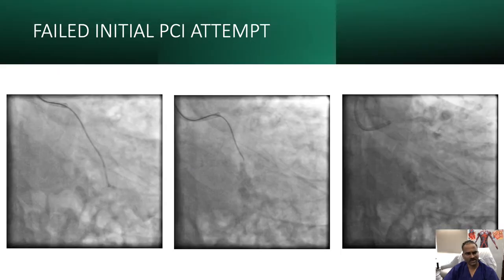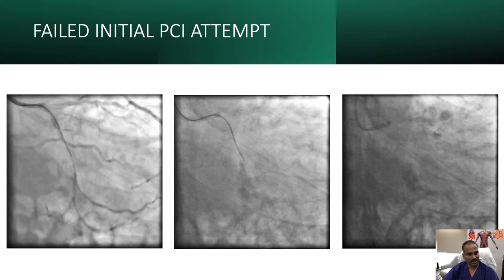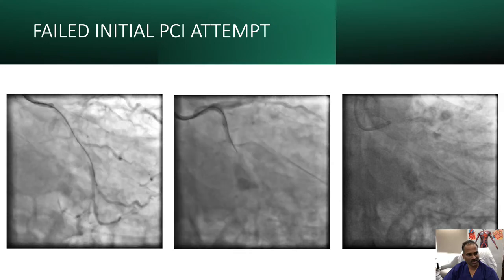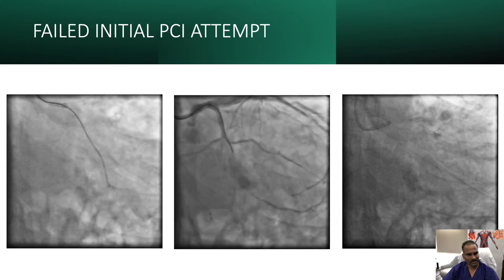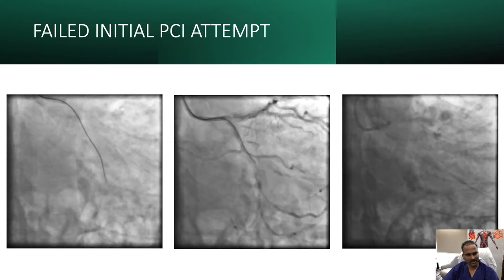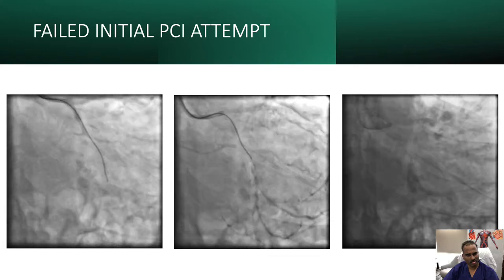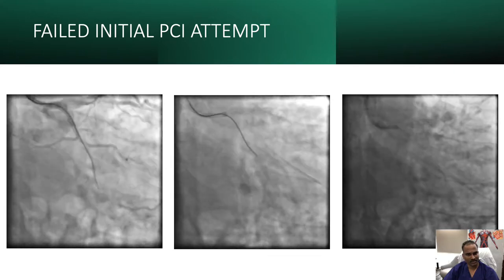The right coronary is basically non-dominant, small vessel, normal. During the first attempt, a Gaia wire went subintimally. After pulling back the wire, there is a clear subintimal contrast tracking which is quite visible, and the procedure was stopped because of the wire position.